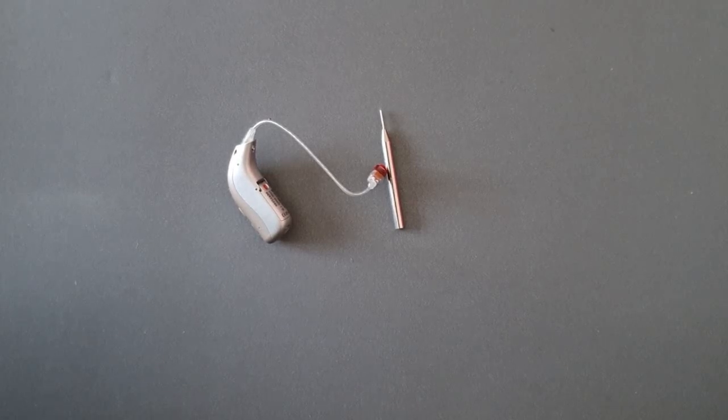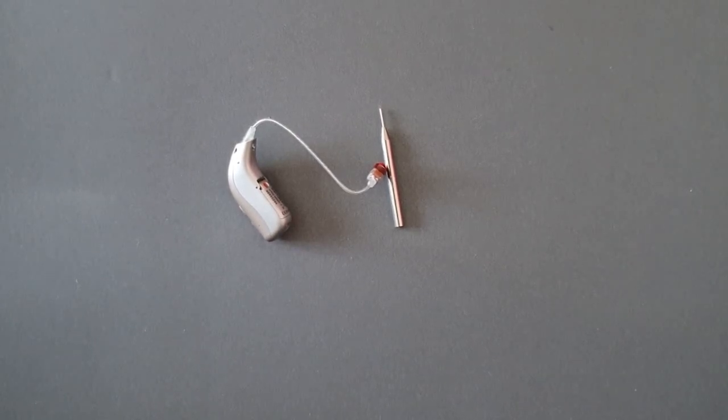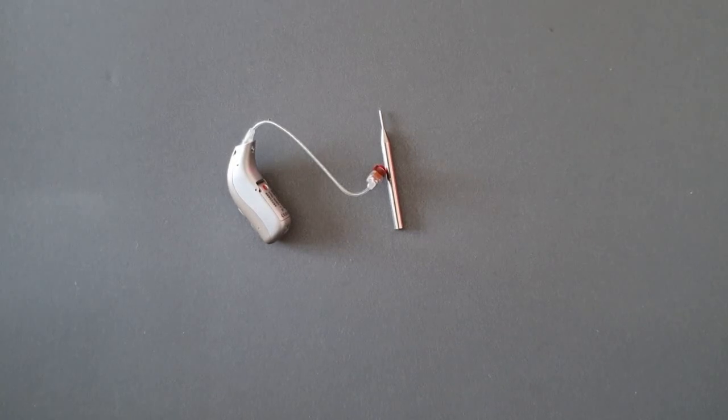Hi, welcome to Bridget Harley Hearing Care Ltd. Today I'm going to show you how to change your Minifit RITE speaker wire from your Bernafon Viron hearing aids.